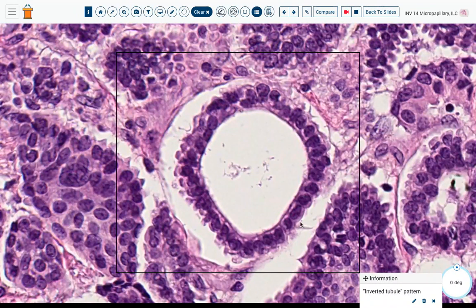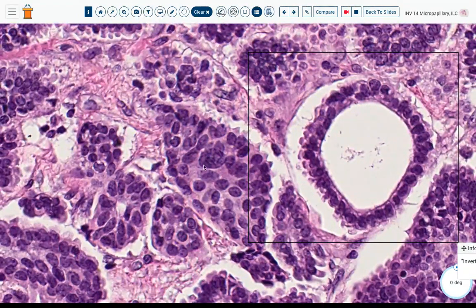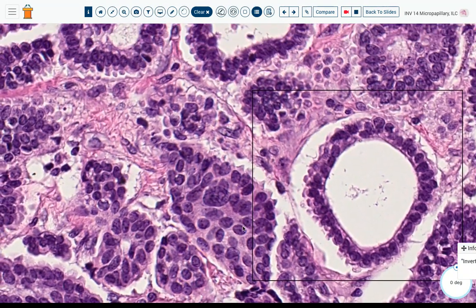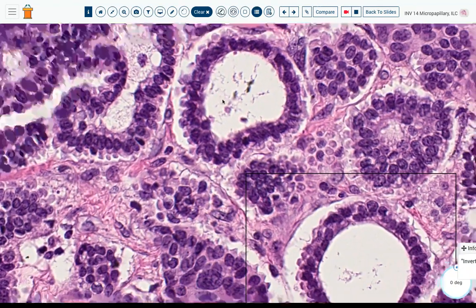If you wanted to stain this, you could stain it with EMA or MUC1, and that would stain the surface. What this is, is actually anchorage independent growth, and it's a hollow ball of cells that you've cut across. I showed you in the first session a similar structure in micropapillary DCIS, but we don't think that they're actually related to each other. And you can see in some other areas of this tumor, you don't always see the hollow ball. Sometimes these are little solid nests, but this is a nice one in that there are so many of these hollow balls of cells present.